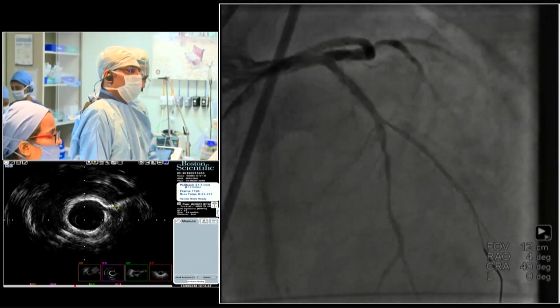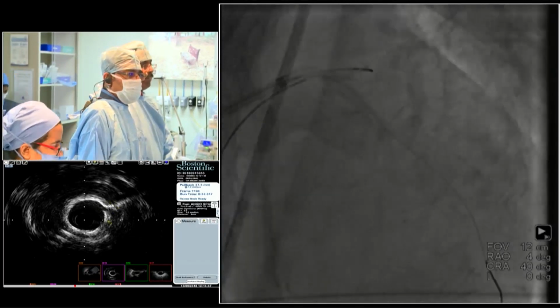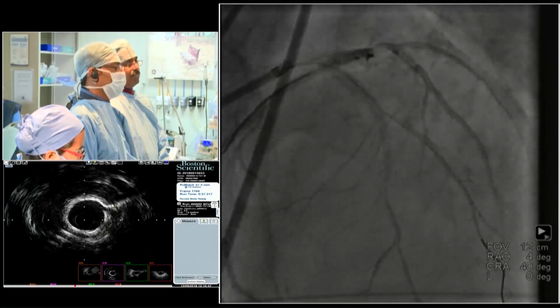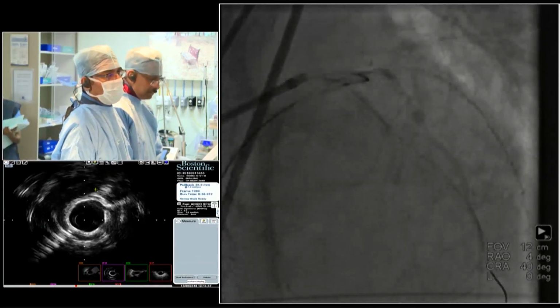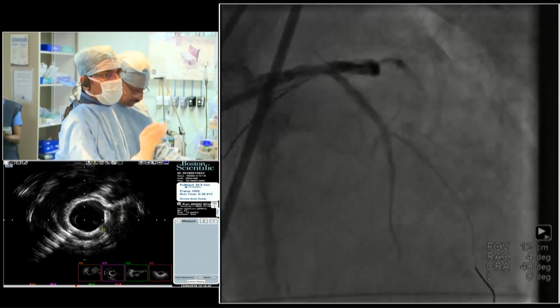I think proximally we cracked it. Can you see a break on one side? It may be cracking mostly at the site of this wire shadow. If you see the first balloon, it did not expand at all. The second balloon expanded. Most probably it should have given way. Can you see a crack at 4 o'clock here? Yeah, I could see it, but still it is almost around 300 degrees. And another at 2 o'clock?